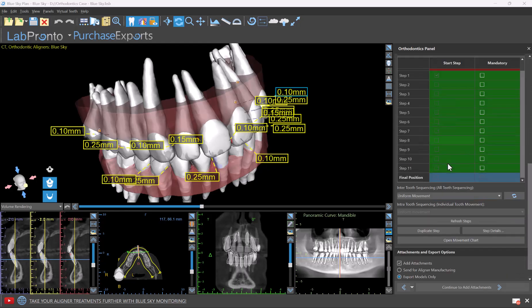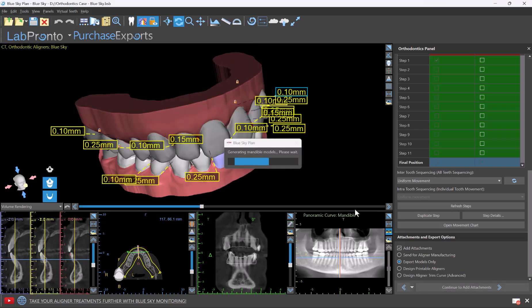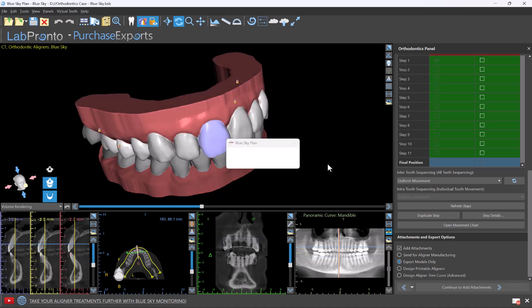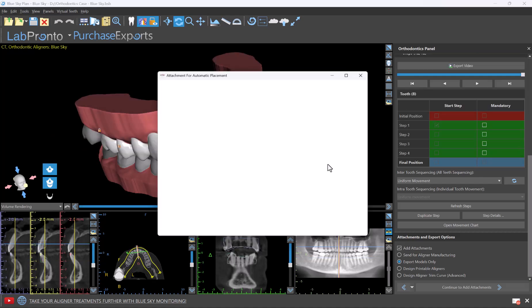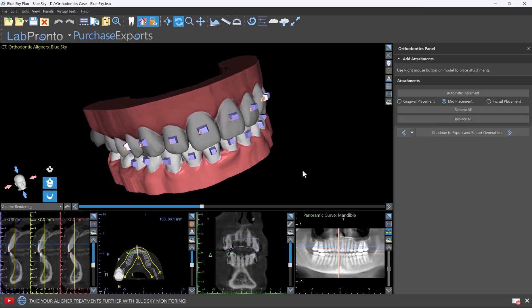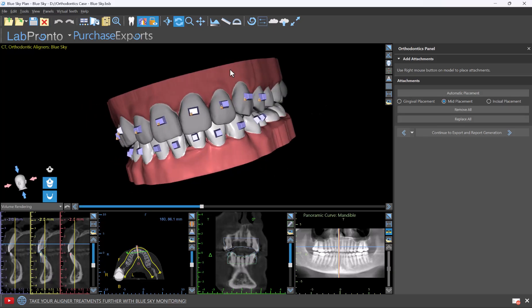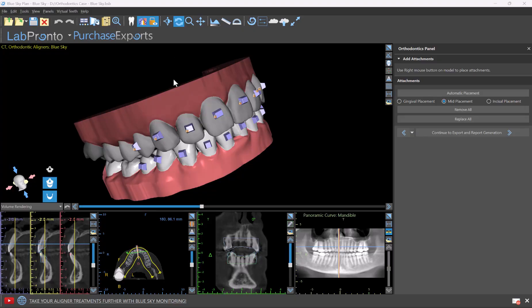Automatic attachment placement. When you continue prior to export, we have a step to add attachments, and the attachments are added intelligently based on the step and teeth movements. You can select the relevant shape — small, medium, and large — and then click the add button. We have options for gingival placement, mid-placement, and incisal placement, adding the attachments to the relevant teeth based on the digital plan. If needed, the placement can be modified or the attachment can be removed.